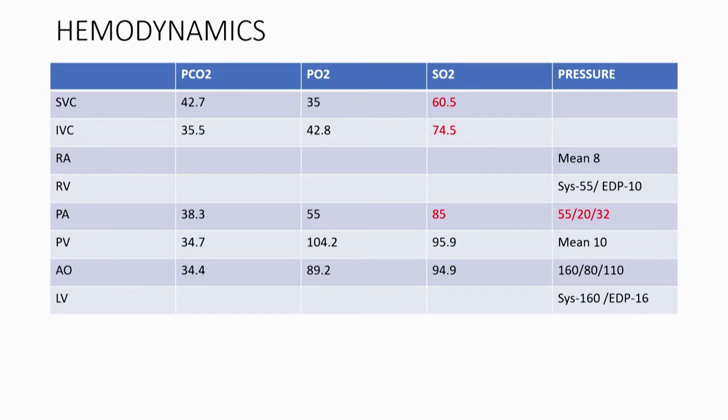Today's plan is ASD device closure guided by intracardiac echocardiography. So we have done baseline hemodynamics for this patient.